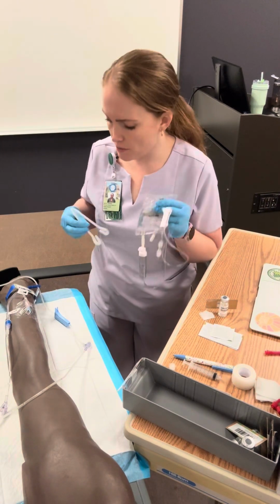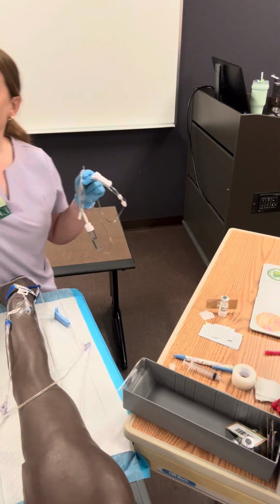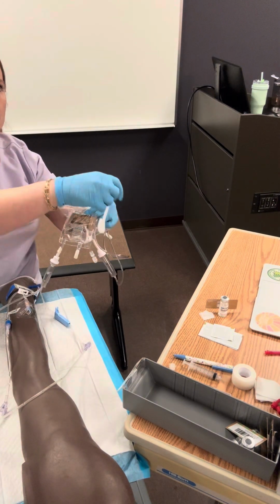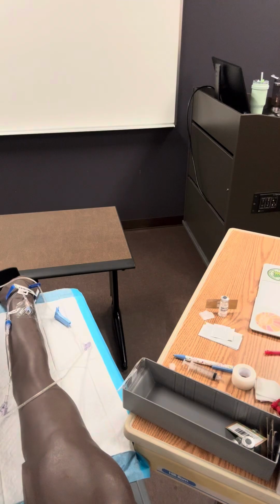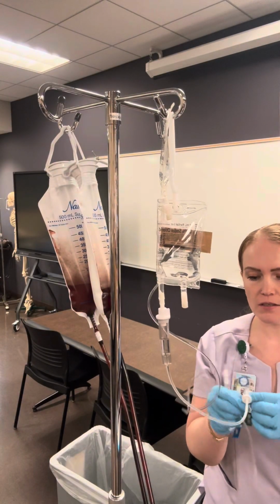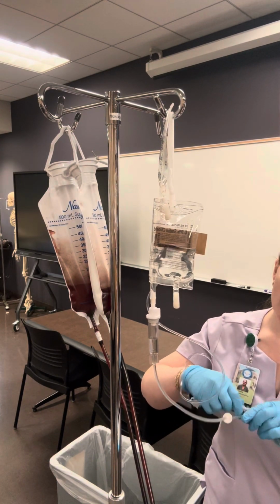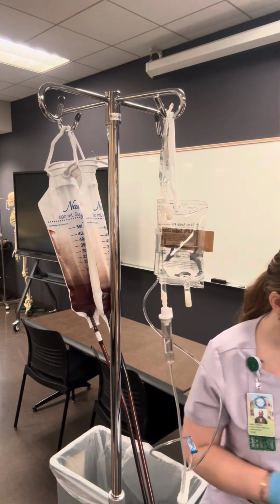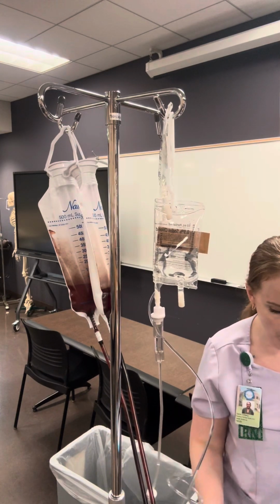All right, now we are getting ready to hang our piggyback. So I'm going to remove our primary bag, and this will now go on the hanger to be lowered, and this will go above. I'm going to clean the port closest to the top here, and I'm going to unclamp, and then I will unclamp the primary tubing.